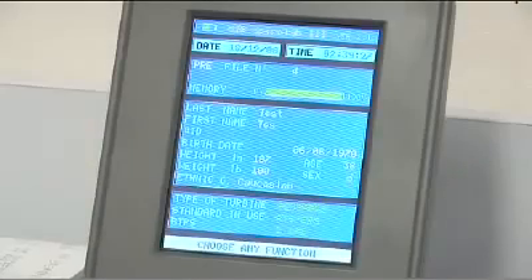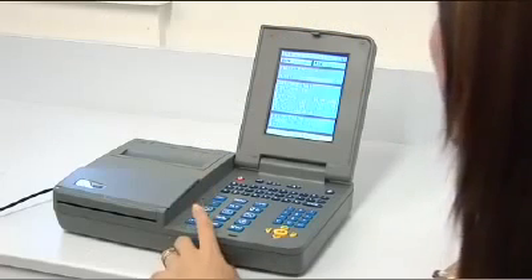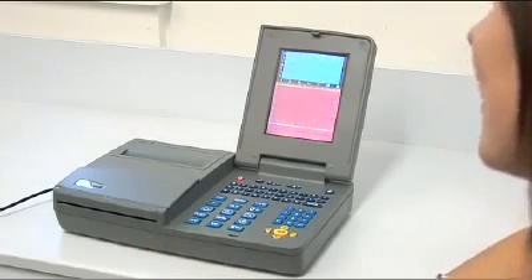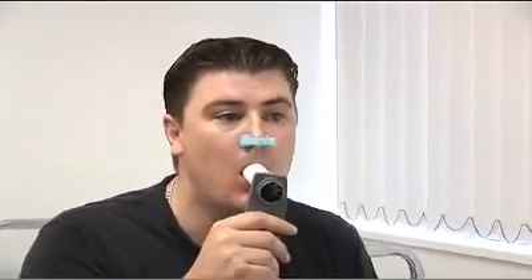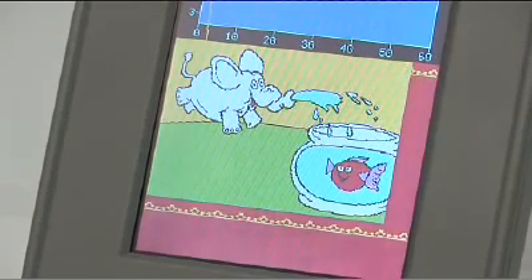The MIR SpiroLab 3 can provide the best opportunity for a consistently valid manoeuvre by providing the patient with a picture-based graphical incentive that lets the patient know how they are performing in real time.